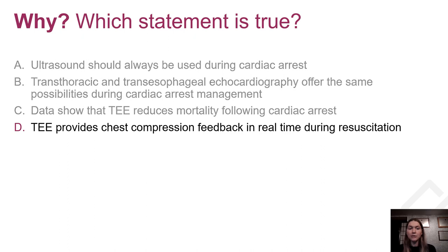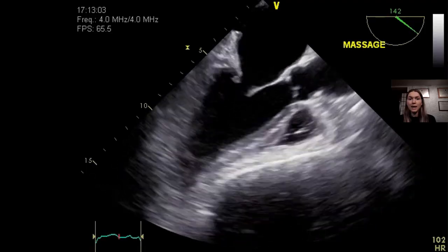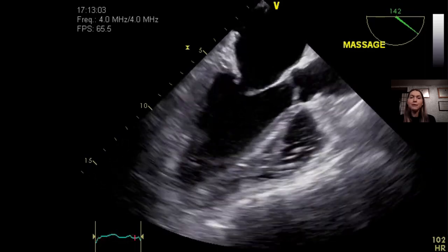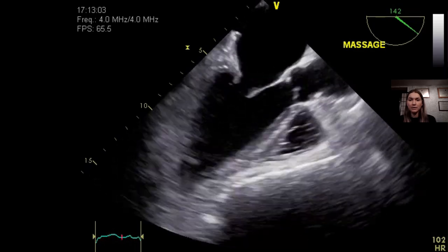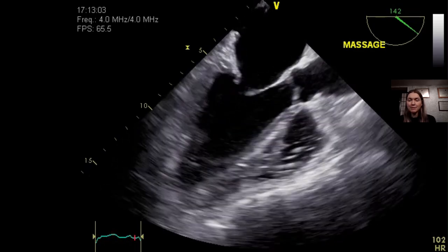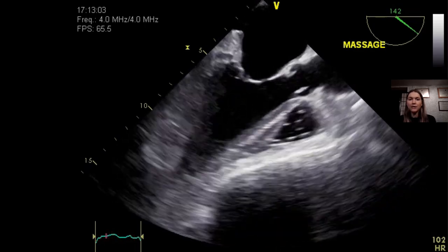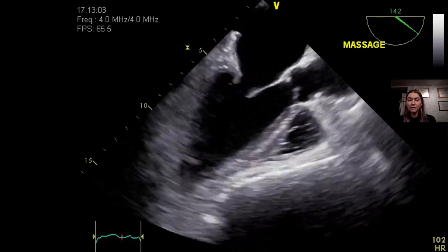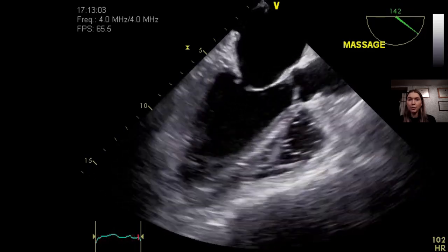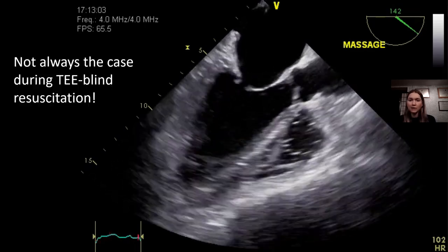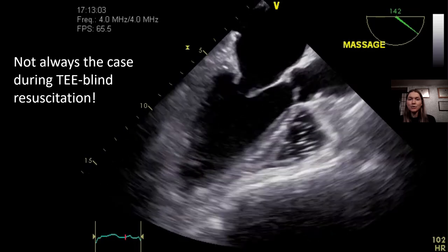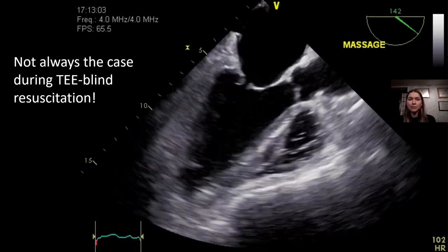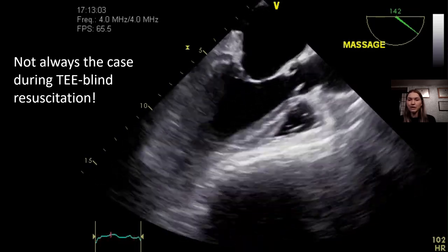The answer is D. As demonstrated on this TEE mid-esophageal long axis view obtained during chest compression of a 50-year-old patient in cardiac arrest, you can see how CPR has been optimized to allow LV ejection through an open LVOT and aortic valve during compression phase. Be mindful that this is not always the case during TEE-blind resuscitation, and this is one of the reasons why TEE can play an essential role during cardiac arrest.